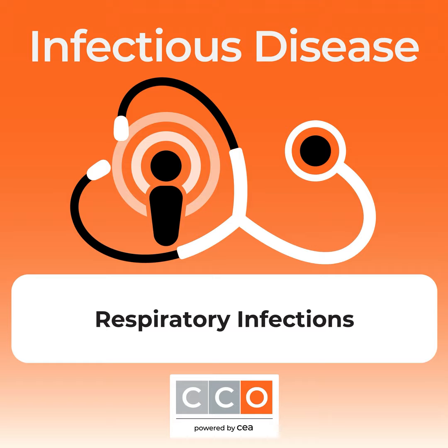Now, another important thing is that this panel can be useful by detecting organisms that are common causes of pneumonia, like Pseudomonas and Acinetobacter. These organisms are often frequently resistant to empirical antibiotics that you might have started for your patient. And essentially, no matter which antibiotic you pick for your patient, about a quarter of the time, the organism, if it's Pseudomonas, is not going to be susceptible to whatever you picked.